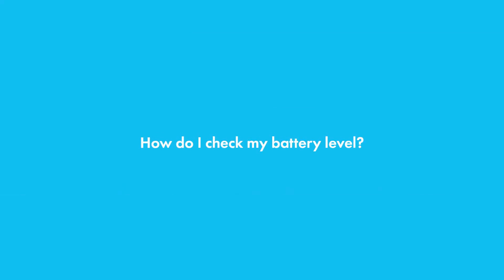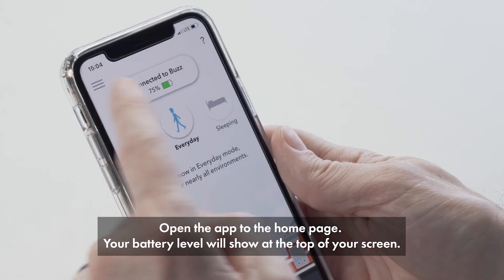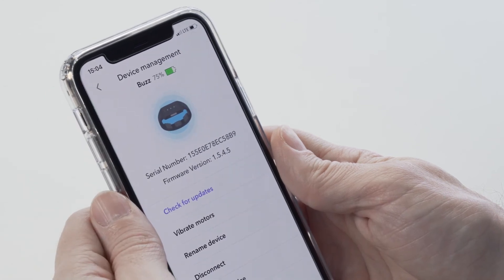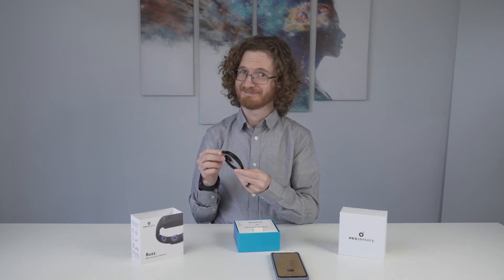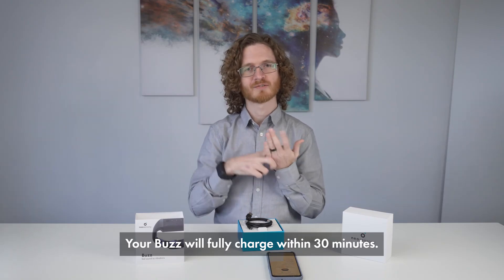How do I check my battery level? Open the app to the home page — your battery level will show at the top of your screen. When it's time to charge your Buzz, use the charging cable in the box. Your Buzz will fully charge within 30 minutes.